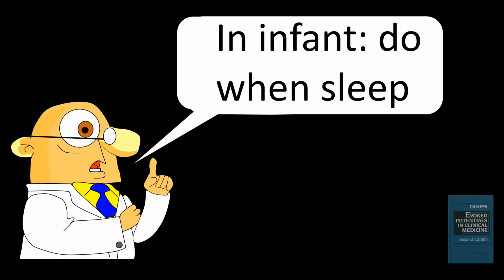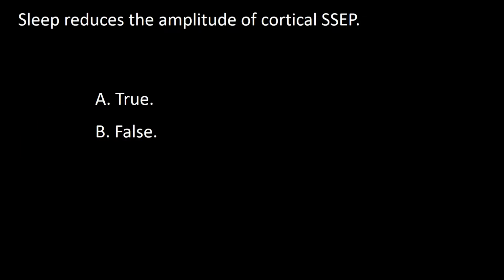Now, in infants and young children, somatosensory evoked potential is often done when the patient is asleep or sedated. This fact should be taken into account at the time of generating normal controls for each lab. So the answer to this question is A.